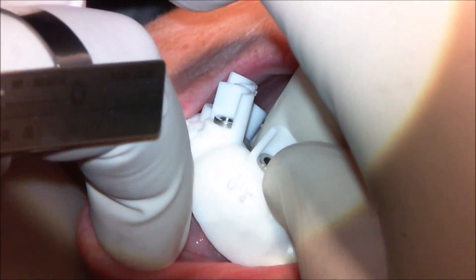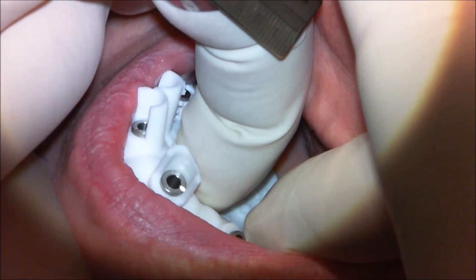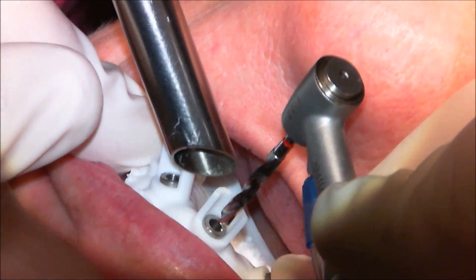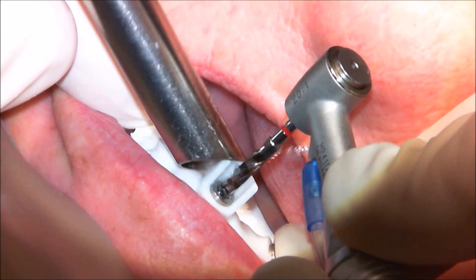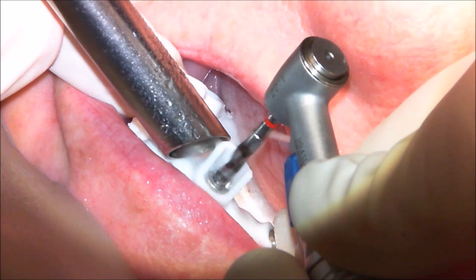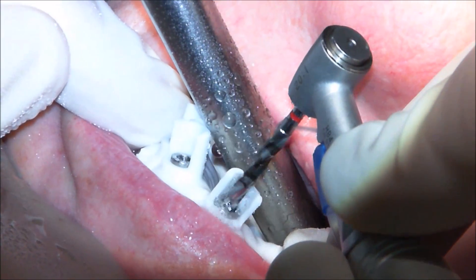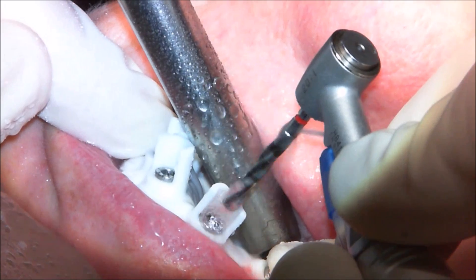Here we have the 3D printed guide going into the mouth. Because the guide is made to be exactly the same as her relined denture, I knew it would have plenty of stability and there would be no need for stabilization pins. Just by keeping two fingers on it, I'm able to stabilize the guide very well. We're starting out with the long drill for a 3.0 implant — undersizing all of these osteotomies — and I'm punching straight through the tissue, then pulling out to clear tissue debris before going any deeper.